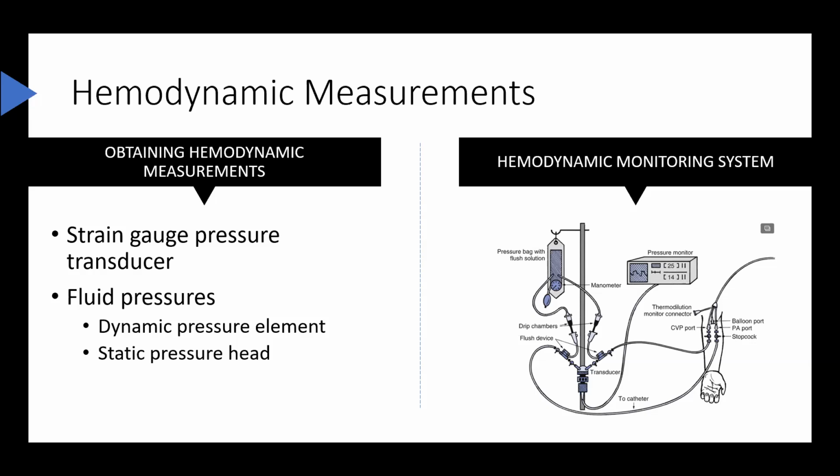Once the phlebostatic line, or the mid-thoracic line of the patient, has been determined, it is important to zero balance the transducer to this reference point. Zero balancing the transducer references the transducer to atmospheric pressure, which is usually read as 0 millimeters of mercury.